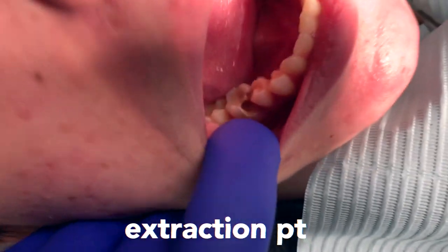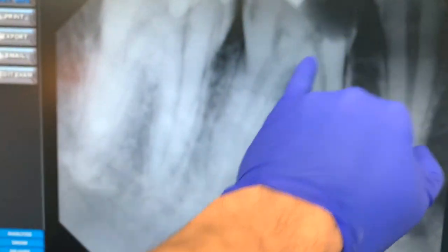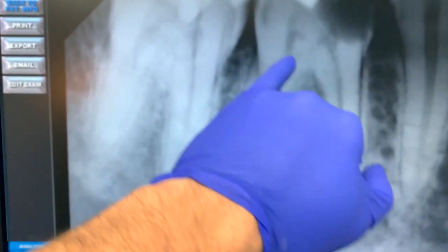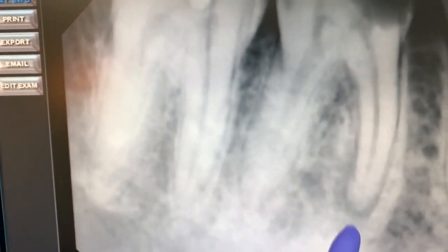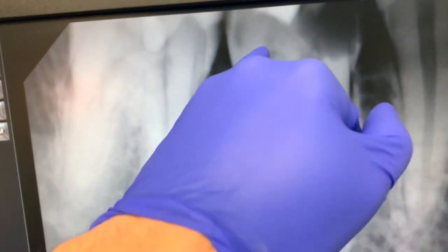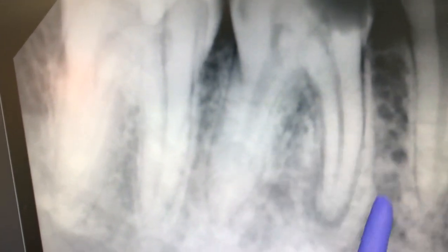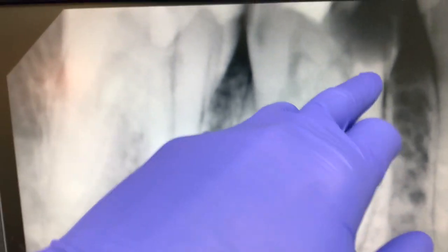So this patient has presented with a large carious lesion on their lower first molar. And if we look on the x-ray, we can see how the lesion has gone into where the pulp chamber of the tooth is, and that's resulted in an infection beneath the tooth. The patient has decided that extraction is the best option. I do think that there's a chance that the tooth may end up fracturing. If that's the case, likely what we'll do is we will section the tooth into two pieces, elevate out the first root, then elevate out the second root as a way of successfully removing the tooth without causing the patient too much pressure, in light of the clinical presentation of the crown.